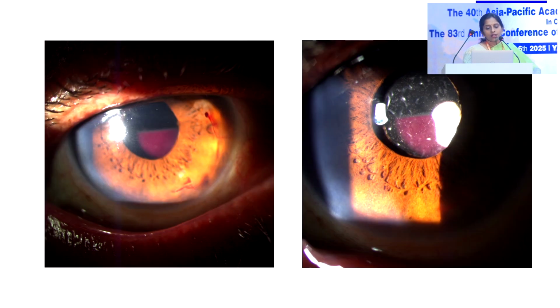This is again a patient from Andaman who had a hyphema of 3-4 millimeters, which resolved. And then after the hyphema resolved, in the postoperative visit when he came after 2 weeks, there was blood behind the IOL. Almost half of the visual axis is covered by blood, and he was leaving to Andaman that day, so we had to actually take him for surgery and wash this.